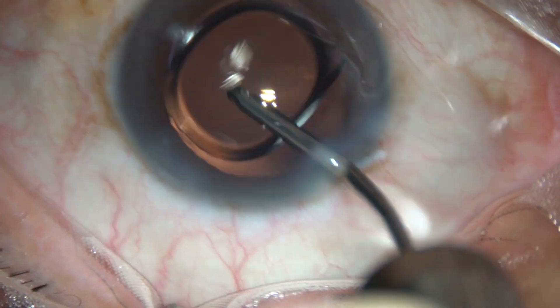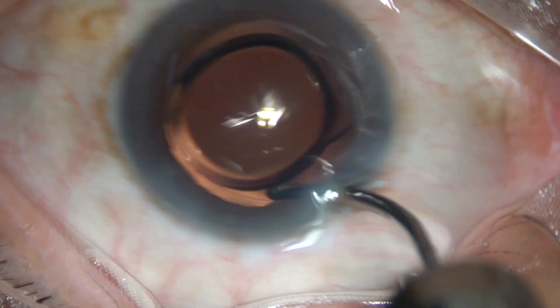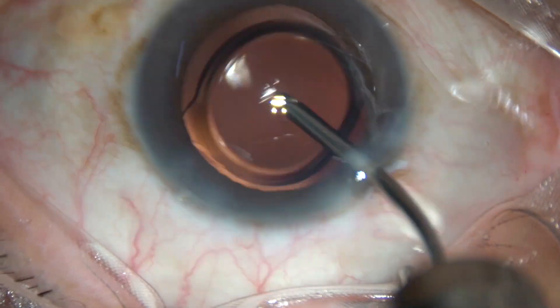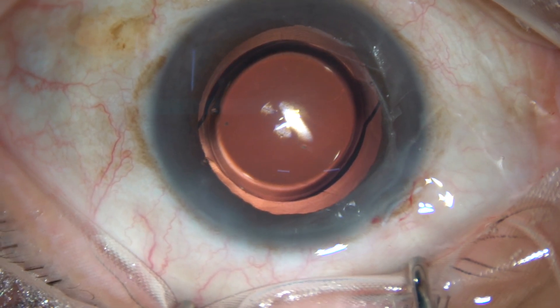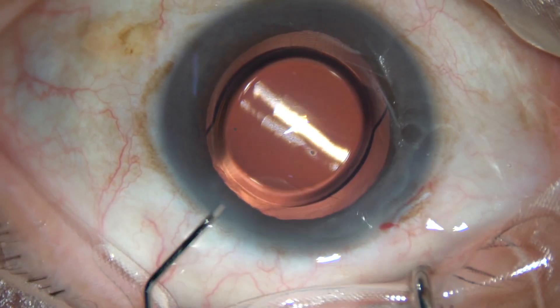And now the irrigating probe is introduced through the main incision. The lens is dialed, and whatever viscoelastic substance was there in the lumen of the cartridge is removed by irrigation.